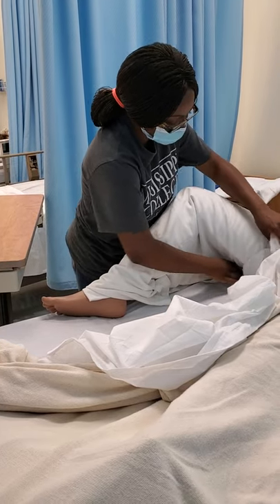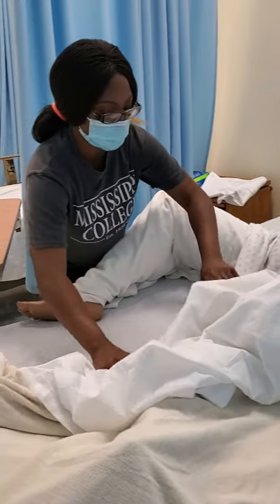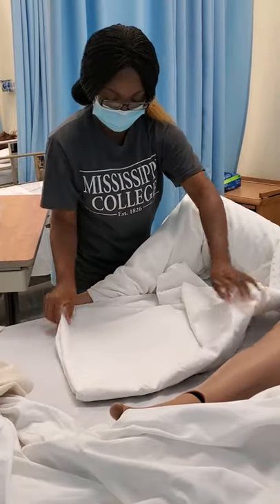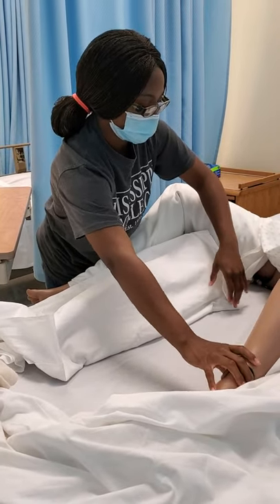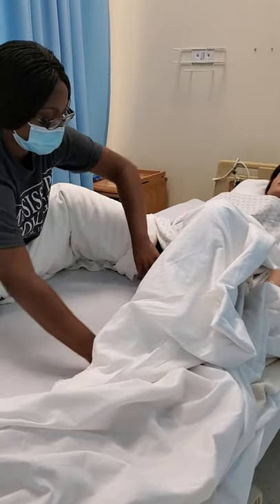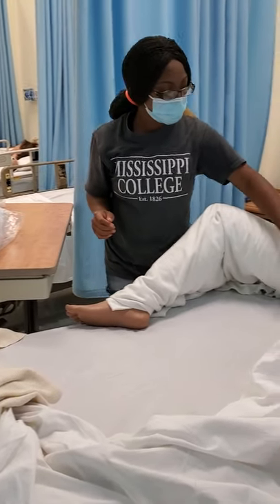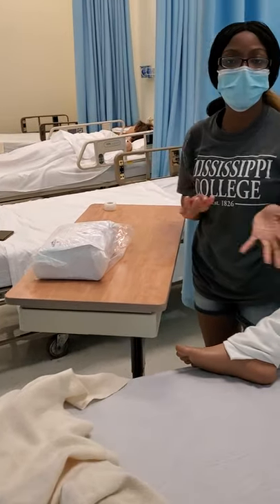And I'm going to make sure to tuck it so that it doesn't get in the way of my field, so it doesn't contaminate it. Alright, now at this point, I'm going to go ahead and expose my patient. And now I'm going to open my catheter kit. But before I do that, I'm going to perform hand hygiene.